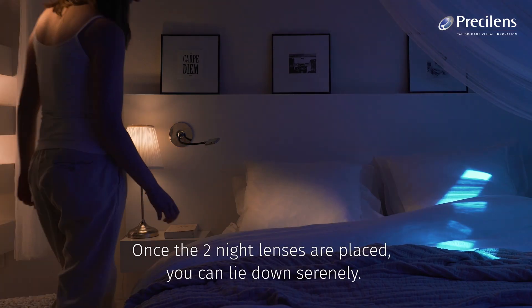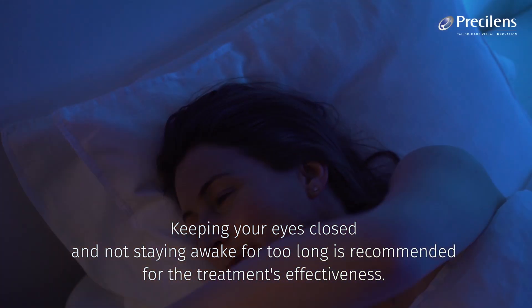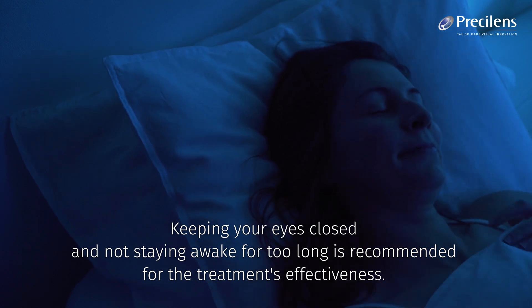Once the two night lenses are placed, you can lie down serenely. Keeping your eyes closed and not staying awake for too long is recommended for the treatment's effectiveness.